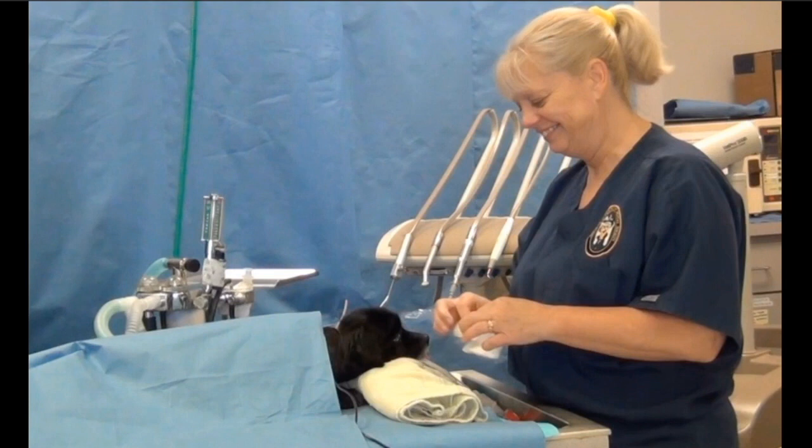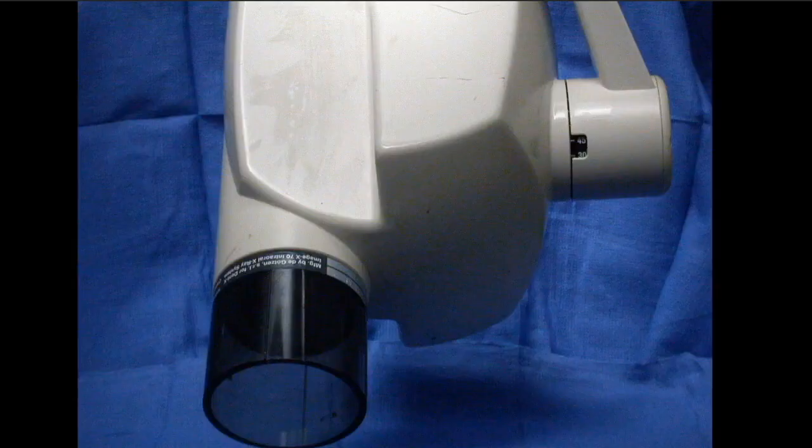We've got a parallel patient that we can now utilize what is on all radiograph units, whether they're human or veterinary — and that is the little number designation on the right side of the tube head that tells you what angle the tube head is set at. So if you're not aware of that on your machine, look at it when you go back to your office and start using that to determine how to take radiographs. You don't have to do that bisecting angle technique where you try to figure out where the tooth is, where the tube head is, and where the film or sensor is.